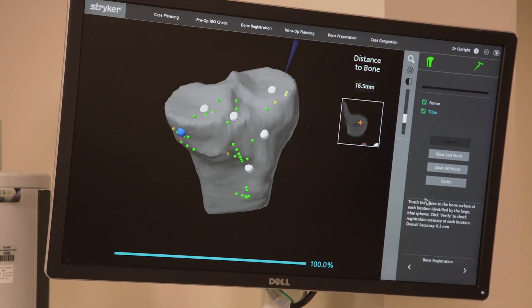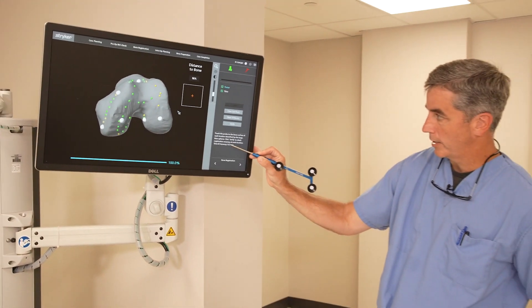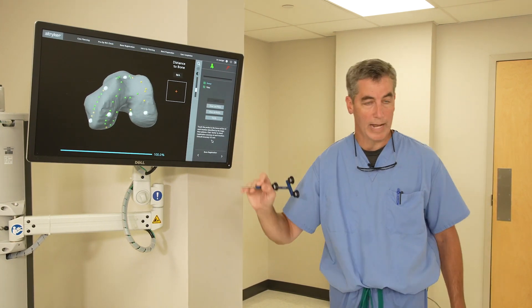It also gives us an accuracy level. You can see it's identified the bone's location within 0.3 millimeters. That's pretty small — it knows exactly where that bone is.